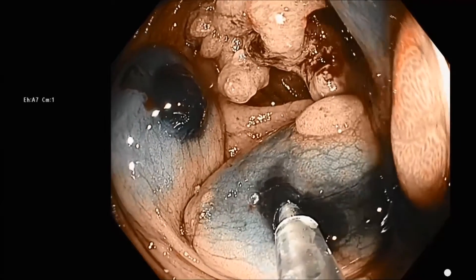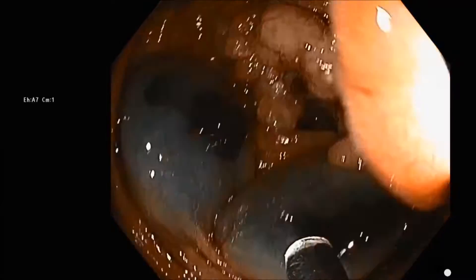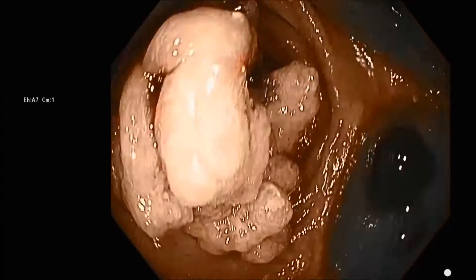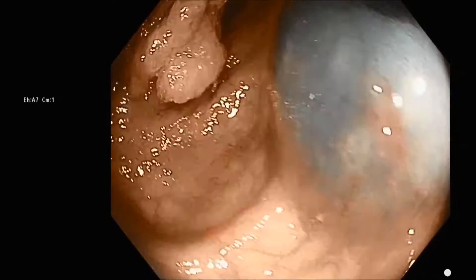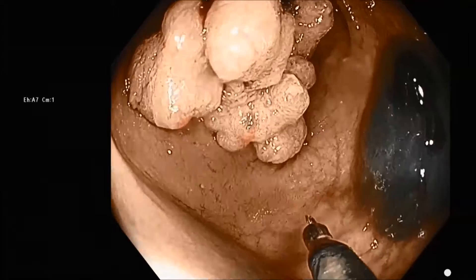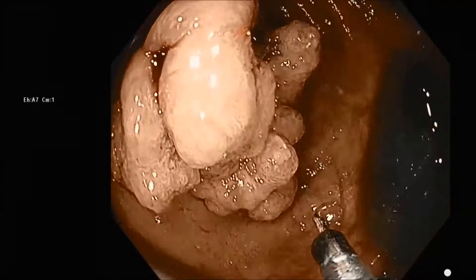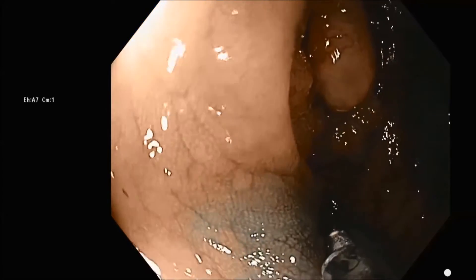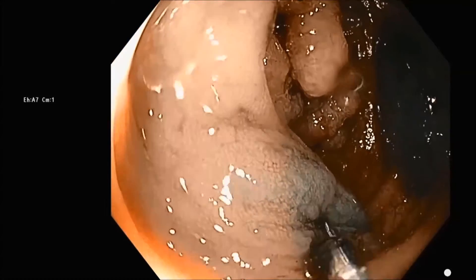When we are finished, we will take a photograph showing the tattoos and the tumor, and then mark on the colonoscopy report that we have put this tattoo distal to this malignant tumor, marking four quadrants with a total of four cc of spot.